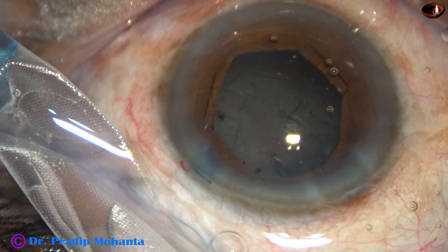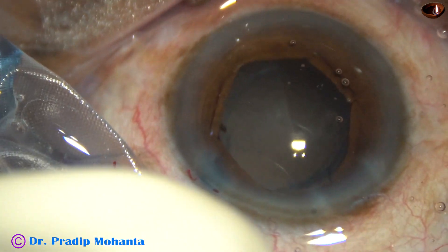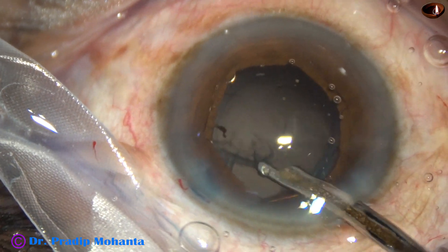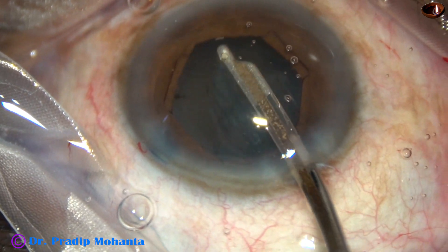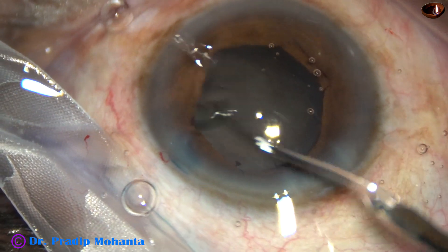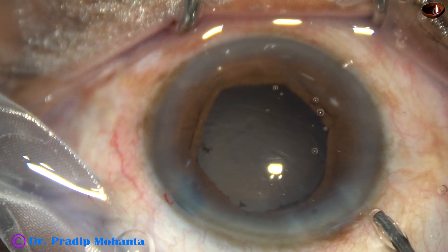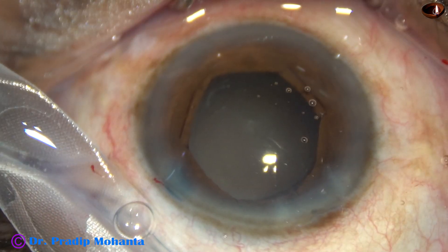And now there is some cortex. 2% HPMC is injected. I am going to use a 23-gauge Simcoe cannula to remove this cortex, using it just like a coaxial irrigation aspiration. I did not have to go through the side port in this case — I could hold the lens material and remove all the cortex. So all the cortical lens matter is removed. I can see there is no red reflex — there is a greyish-white reflex, and this is because of the retinal detachment in this case.